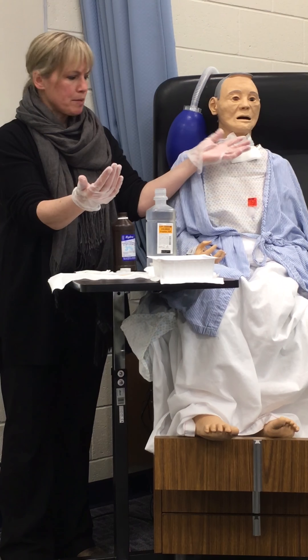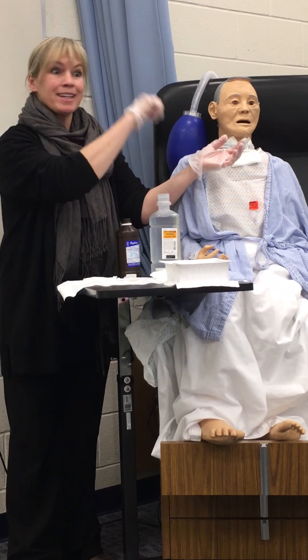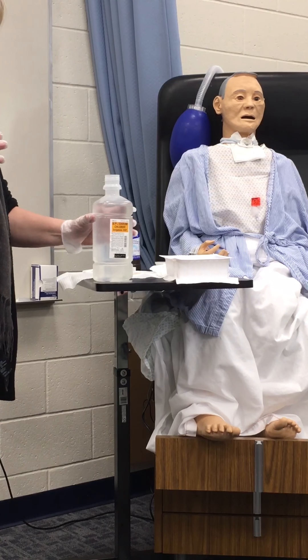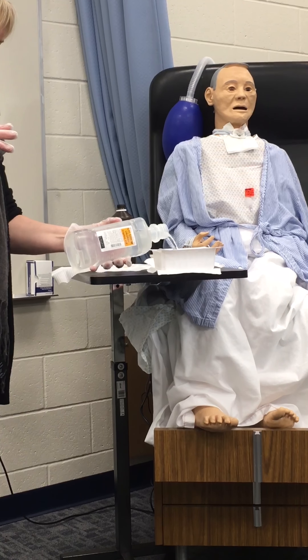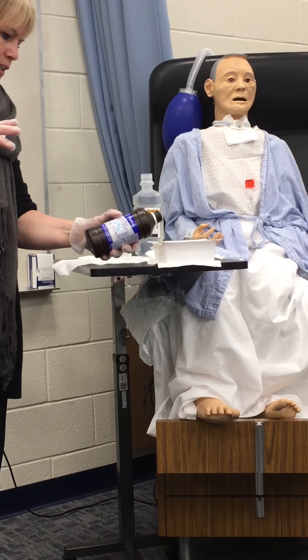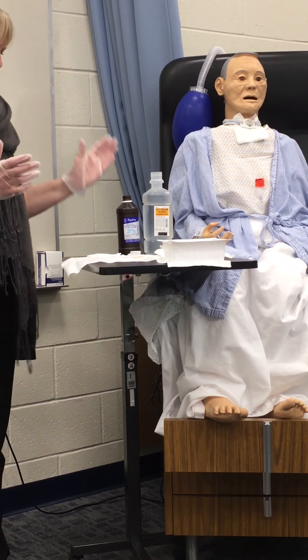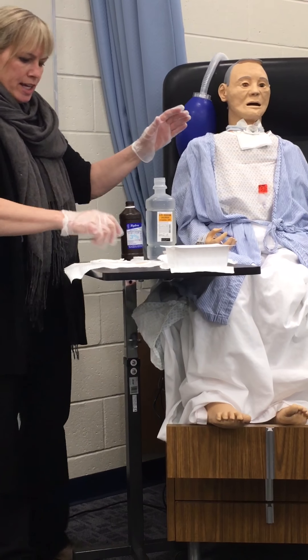Some people will just douse it in there and let it sit. I like to just hold it, clean it, and get it back in because I'm worried about her. I've already touched her, so now this is my non-sterile hand. We want to come around your sterile field — there are two containers here, big and small. It doesn't matter. I usually go left to right, so whatever's facing me. Saline is your rinse, peroxide is your cleaner. You can look at the orders — sometimes they'll say half-half, so you'd have to mix that as best you can. You could put the lids back on, but you don't have to.